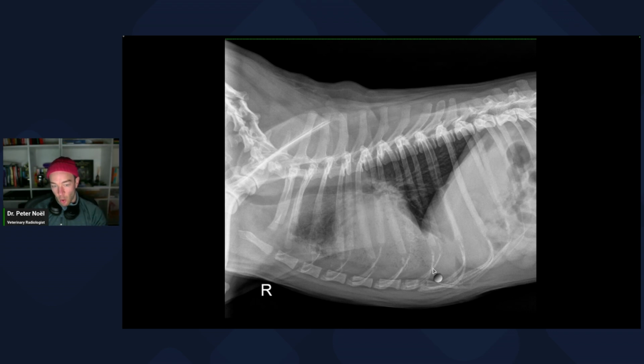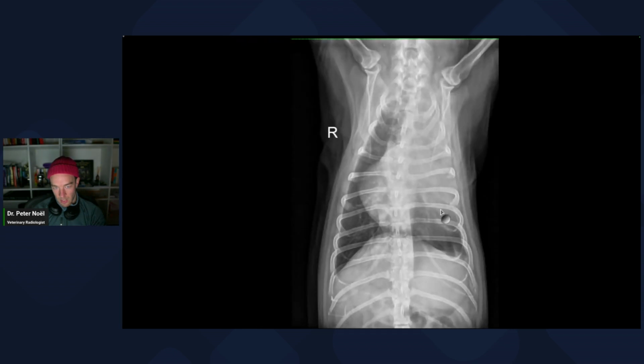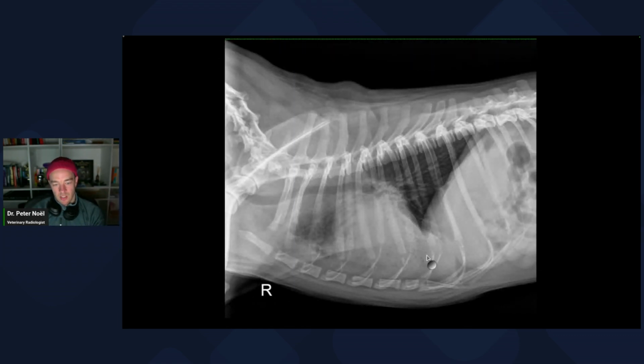I think that's probably a little bit harder. I wouldn't expect you to jump on board with that, but I would expect and hope that you'd see that there's an alveolar pattern, and you should go, oh, I wonder if the dog's got pneumonia. And then you flip it on your side and you're like, oh no, there's this stippling. Now I'm wondering that there's maybe a lung lobe torsion. I do think the bronchus is pinched up here.